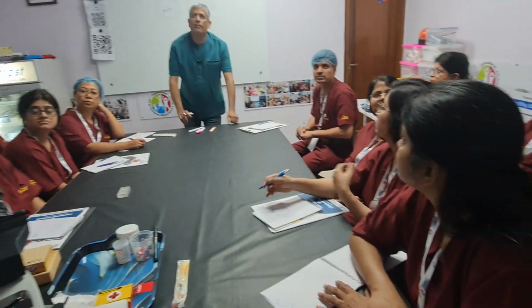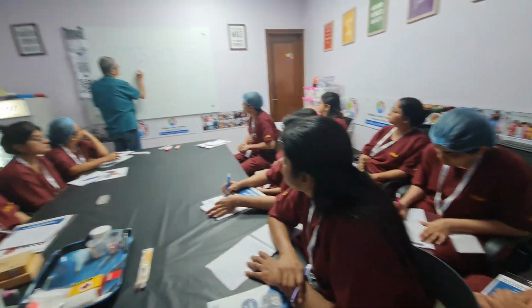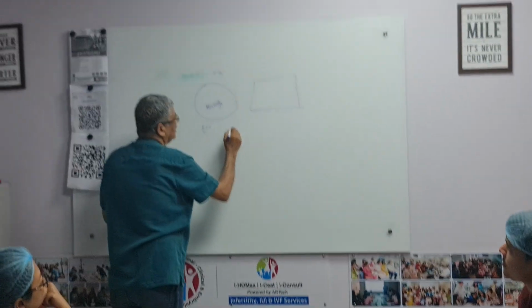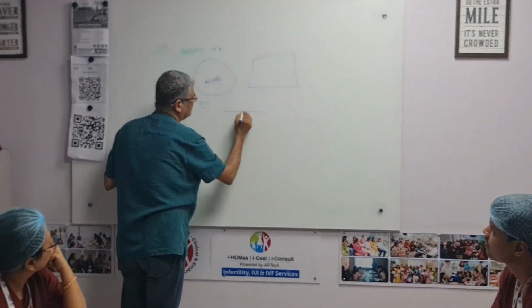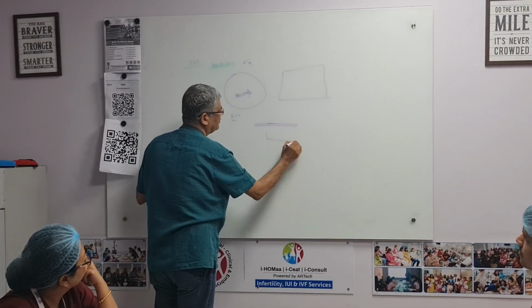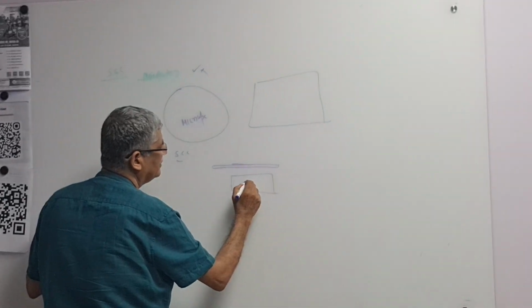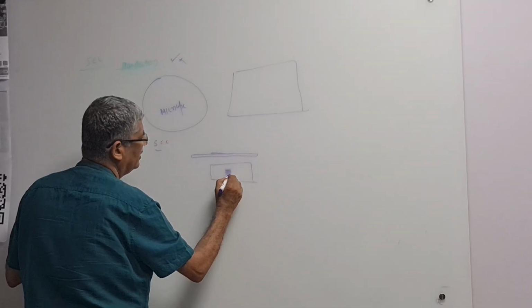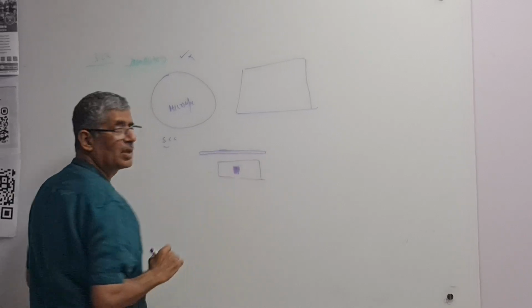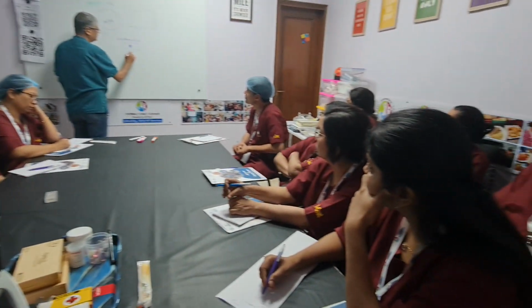Counting them is always a challenge, and you don't know how to do the right accountability. So we use something called a sperm counting chamber. They're made in two ways. Either on the surface of the glass slide itself, we have got a grid in which we have got 100 squares, or we have got a cover slip which has got 100 squares. So we count the number in 100 squares.